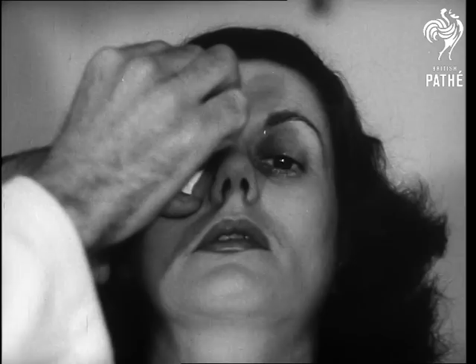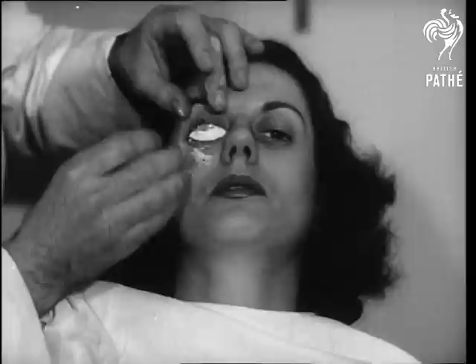This girl is wearing glasses — don't believe it when it's true, and here's how it's done to make contact lenses. The eye is anesthetized, then Sydney optician Penryn Thomas, Australia's only contact lens maker, inserts an impression cup containing a material for taking a cast of the entire eyeball. The mold sets in two minutes and then it's removed.